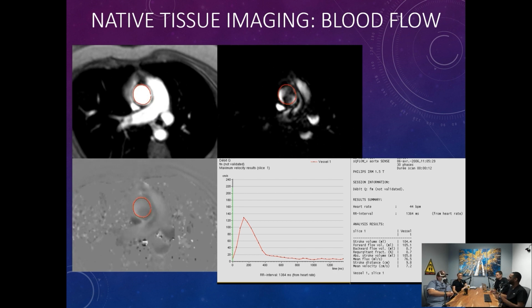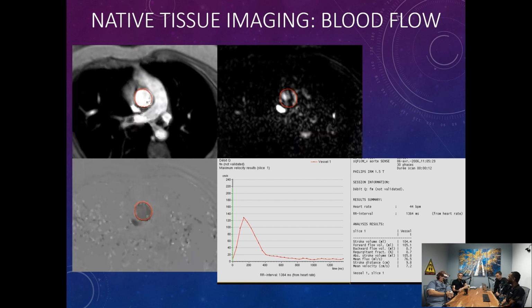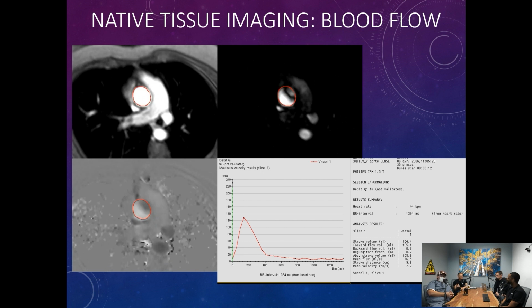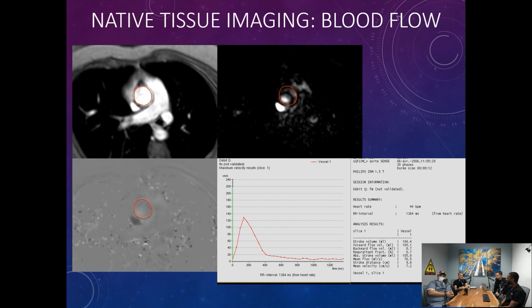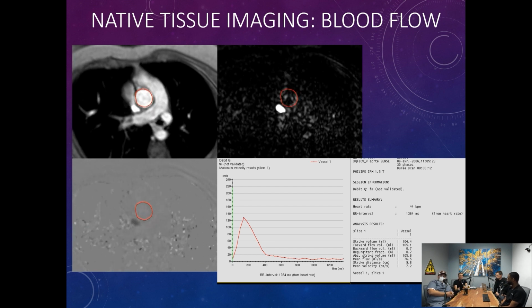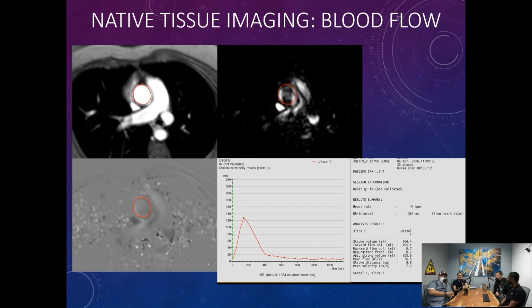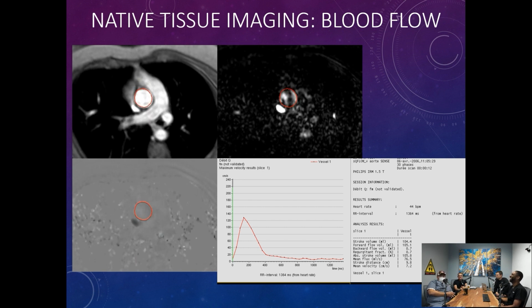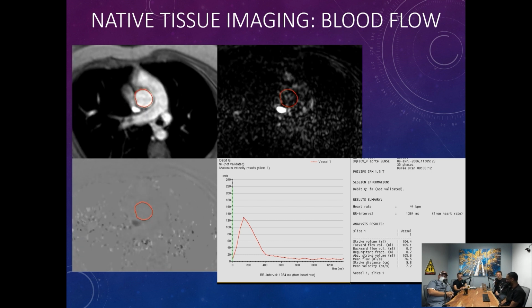Is that one of the recommendations? Like, do people usually have echoes right before they have an MRI? It's pretty common. I would say at least 80%. Yeah, typically echo is more of a first line test because it's cheaper, it's faster to do, it's real time, and it's portable. So whether you're in the ICU, the emerge, or you're outpatient, the machine can be wheeled in. The MR is not quite as, like, Fort Knox. It's a little more of a secure area. So we got to be really careful, especially where we work.